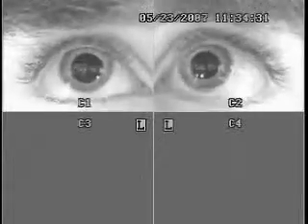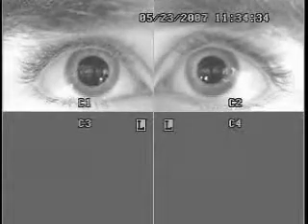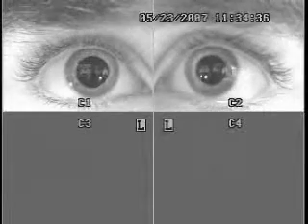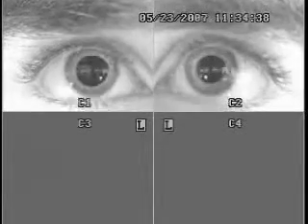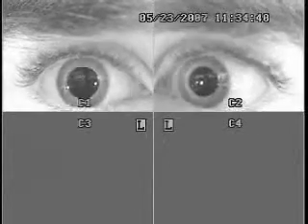This is Dr. Carl Sittek. It's Wednesday, May 23, 2007, and we're testing the subject. We'll call him Matt, prior to the start of drinking, just to check normal eye movements.